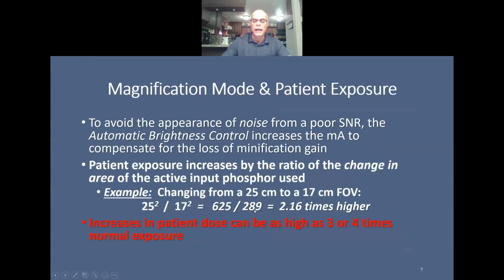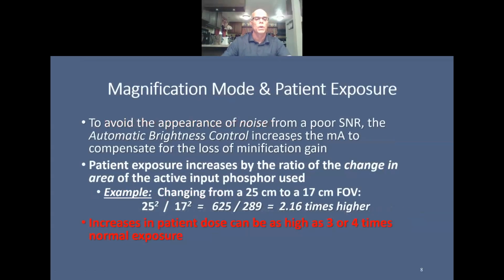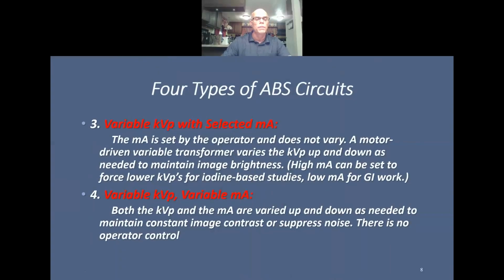Okay, I think I'm supposed to stop there. I told Dr. Haynes I would stop at automatic brightness controls. Anyway, we're going to stop the PowerPoint here, and I will pick this up probably in the fall, guys. Really, that's what I want you to know about the brightness gain. So hopefully this helps out.